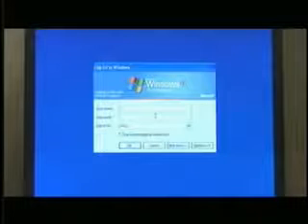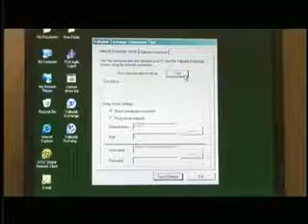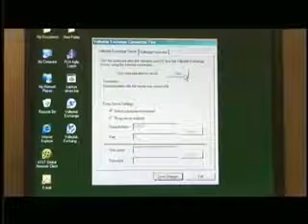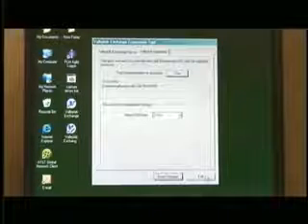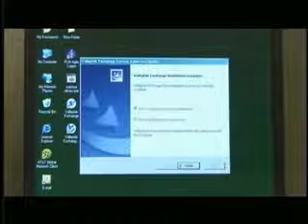After the Valleylab Exchange Service Agent software has been installed and the computer has been restarted, a connection utility icon will appear on your desktop. To check the communication link at any time, double-click on this icon and the utility will open and you can test the connection. As with most software, you are required to restart your PC to complete the process. Choose Yes and then Finish.